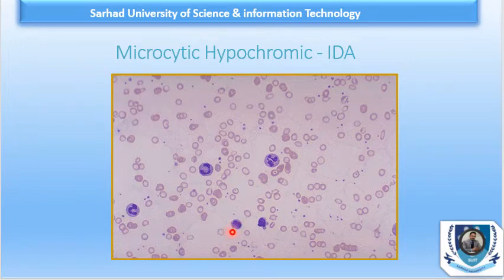If we do not have any clue or something else, so we will. It is a very good indicator for checking the normocytic or microcytic or macrocytic cells. So here this is lower than its normal limit, and already we checked the CBC report. So there we have low MCV. So this is a report.